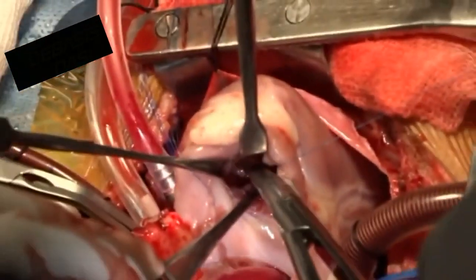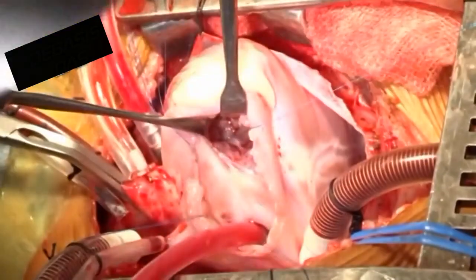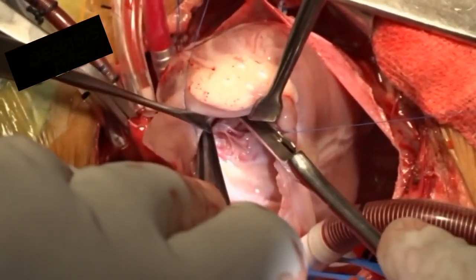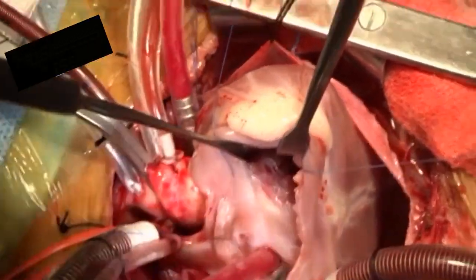We should be able to see the pulmonary valve through the right atrium after sufficient resection. At the same time, it is important not to resect on the septal side.